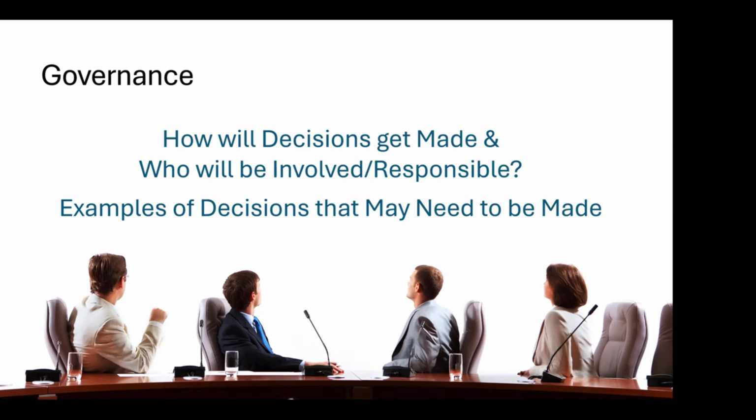Other things you may be asking them about are record retention and purging policies, record correction and acceptance, and data conversion from proprietary formats to others. This can include things like the scope of the data to migrate. Are you going to migrate all exams or only exams from a certain year forward?